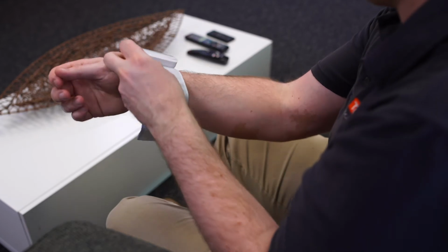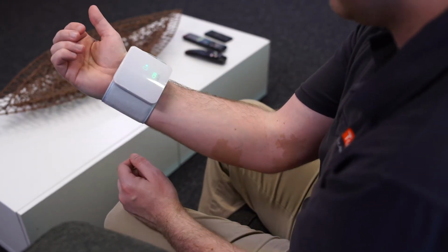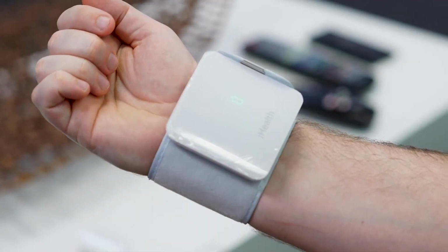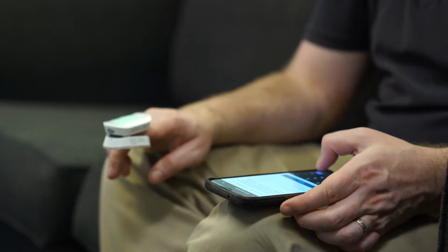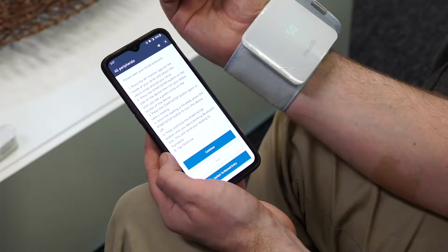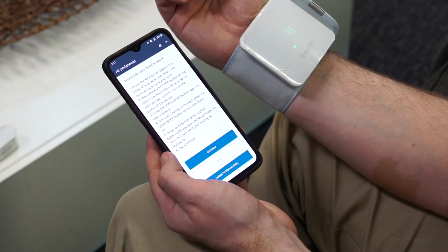Connected Health is the consistent and accurate remote monitoring of a patient's vital signs and well-being data, monitoring patients with long-term conditions within their own homes. myMobile is used to monitor the health of patients in their homes, in care homes, clinics, or any place where people have access to their smartphone or tablet.